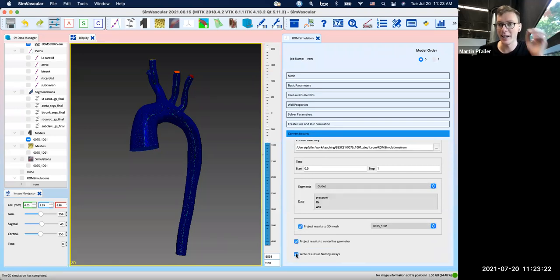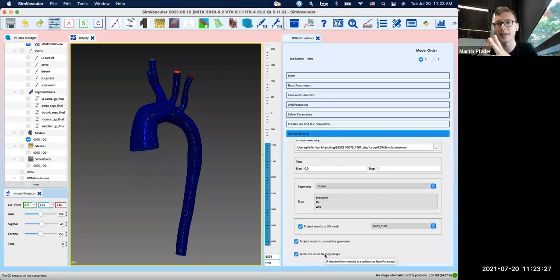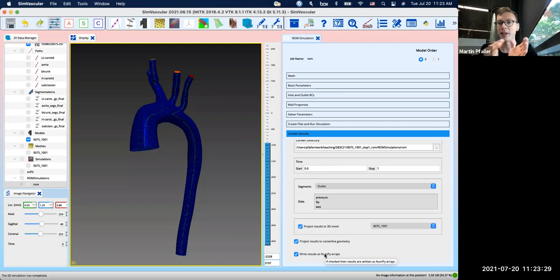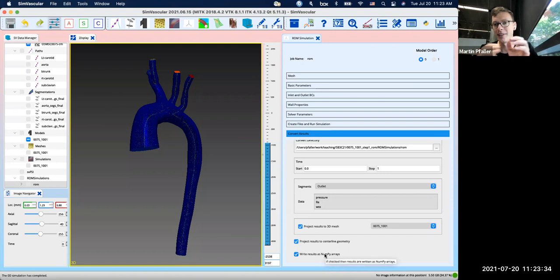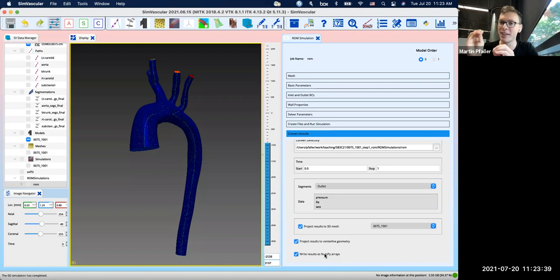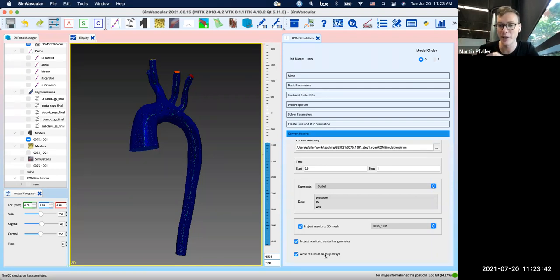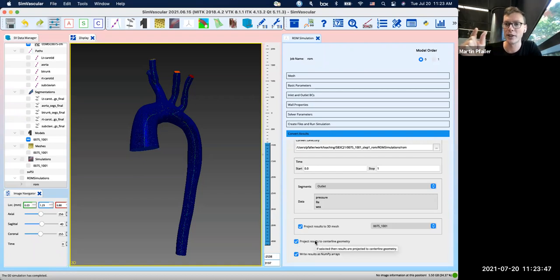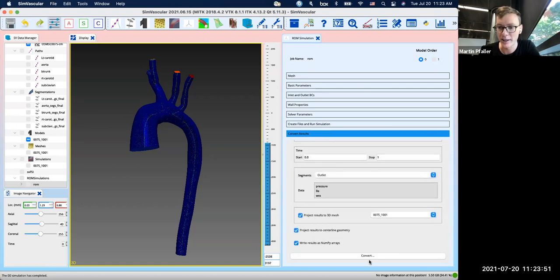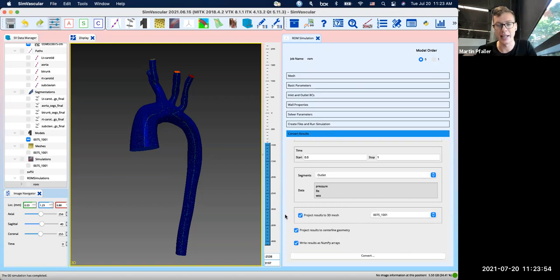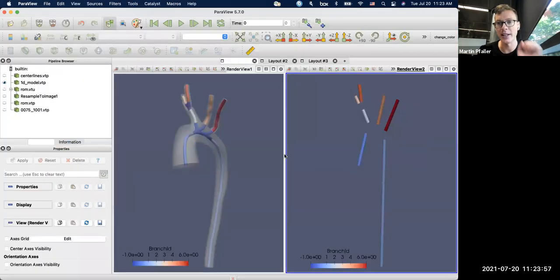And then you can choose which flow values you want to export. And then there are a couple of options. So you can export those results to NumPy in a way where the results are already sorted by branch. So for each branch you get pressure and flow. And the sorting by branch can make it easier to actually figure out in the end where those 0D results belong to in your 3D geometry. Then we also have an option to project those results back onto the centerline and we can also project them back onto the 3D mesh.